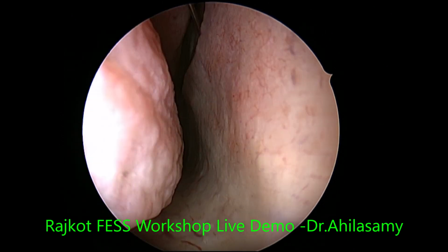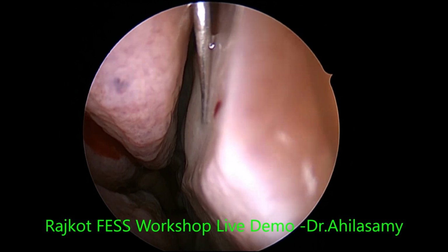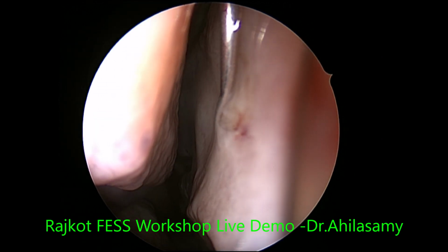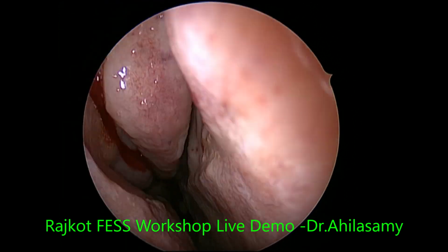I give a little infiltration on the septum near the sphenoid area, and maybe an infiltration on the anterior wall of the sphenoid also. They are not really needed, but definitely they will give an added cushion to the already given blocks.